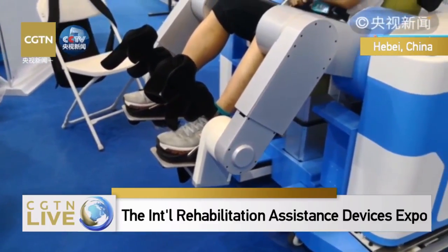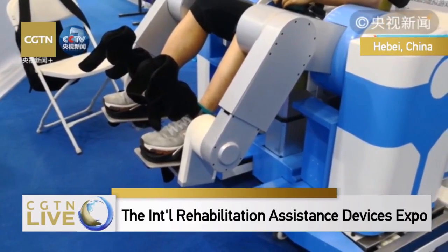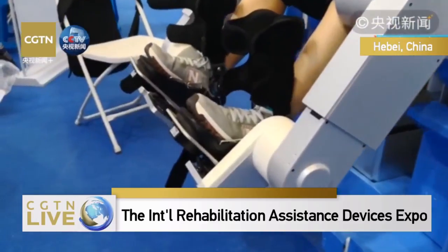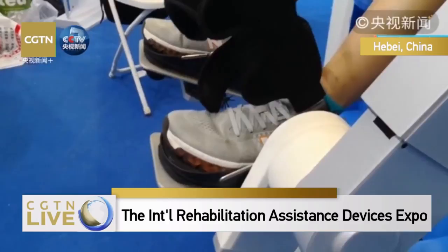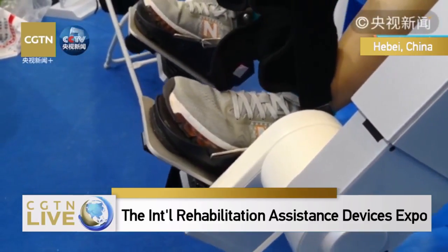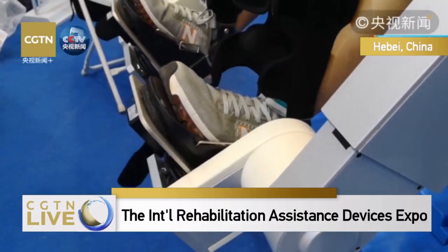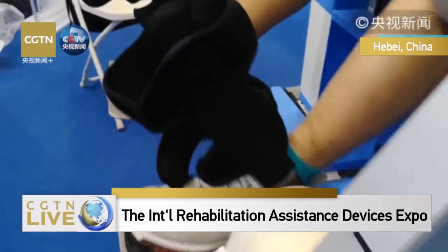Right now, you can see that different joints of this person are moving. Right now, this is the training of the ankles. This device is helping the patient to train the ankles.